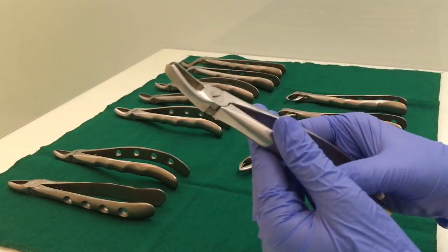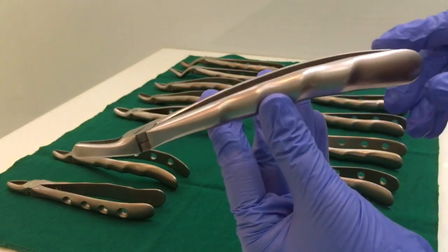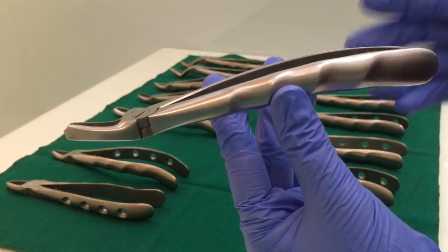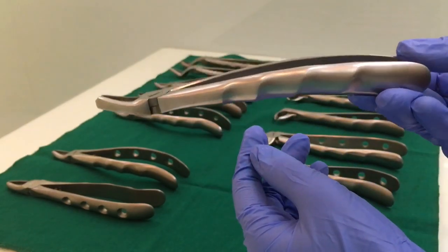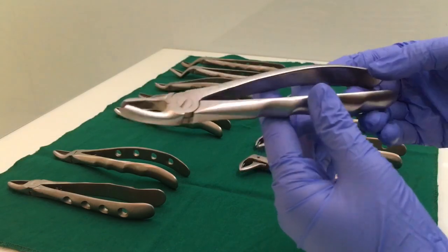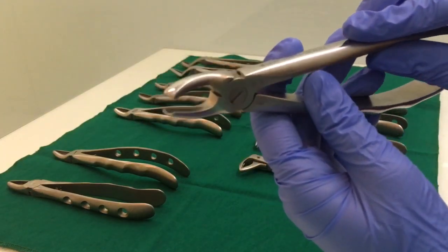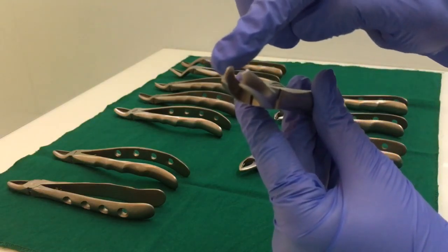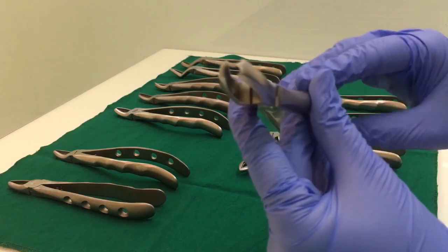This one is the upper molar forcep. Here also, the handle is curved — it is not straight. Now, looking at the beaks, there are two beaks: one is rounded and one is pointed — it has a point.